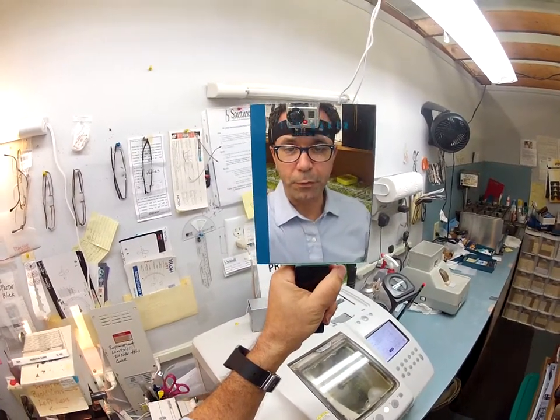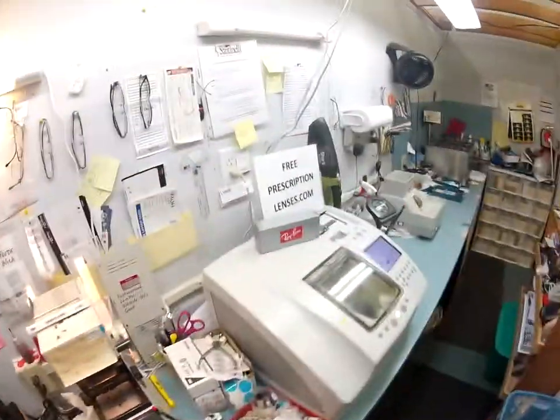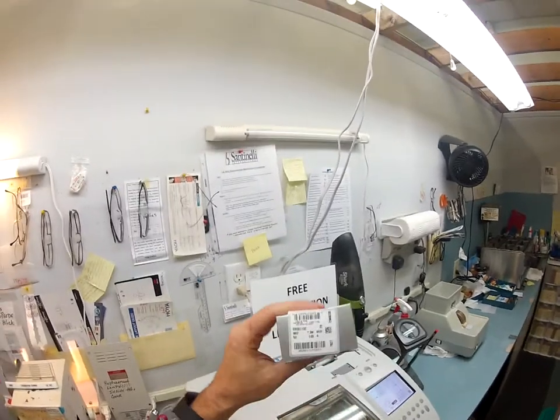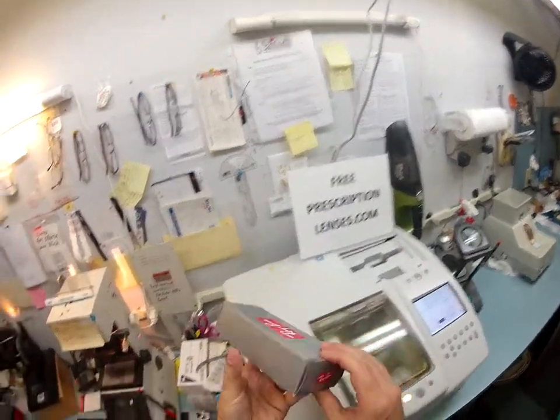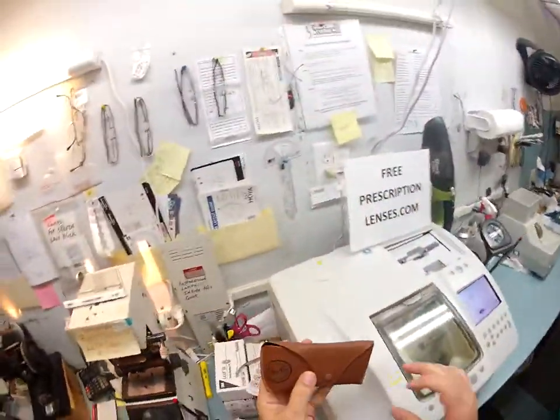Okay Laura, this is Matthew here with freeprescriptionlenses.com, and with the help of my GoPro camera I'm gonna show you how I cut prescription lenses for your Ray-Ban 2132 color 902, which is the tortoise. Let's get to work — we've got a lot of ground to cover because I actually want to show you how your transition lenses darken.